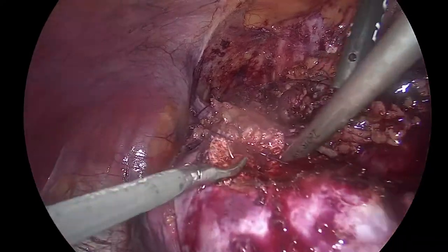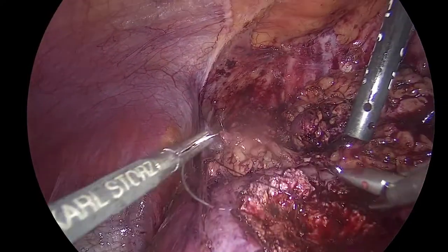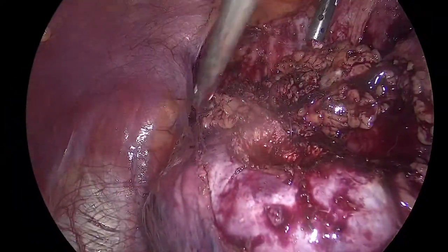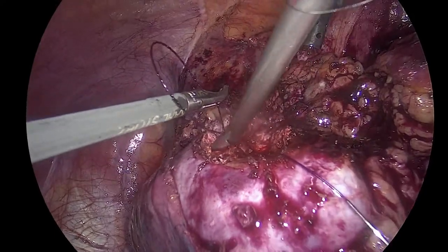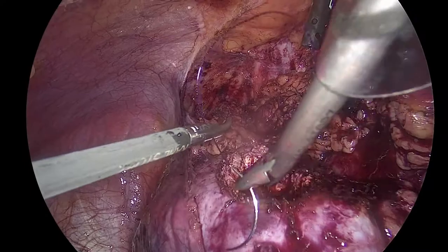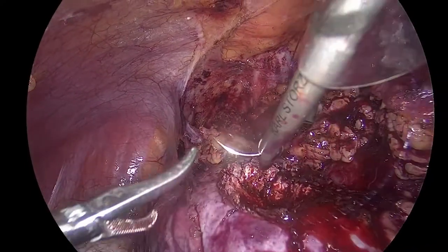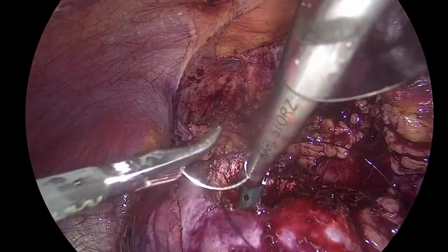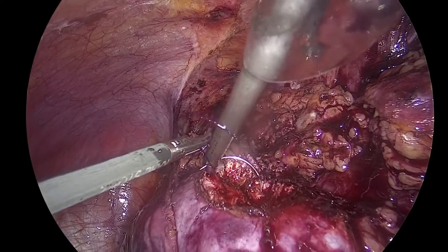Come in, close. Well, I think it's a nice suture. Okay. It has to do with personal preference at this point. I think especially for this part of the suture, probably the renorrhaphy. The renorrhaphy, I do not put barbed. I prefer Vicryl, for example. The renorrhaphy, I put a normal Vicryl on a CT1 needle, but the inner layer, I use normally this one. Leave it, go. Come closer.